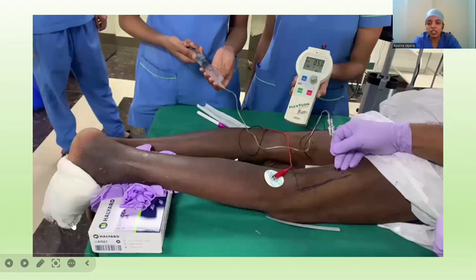Here, as you can see, the patient is positioned in prone position and the landmarks are marked with a pen. So there is the popliteal crease, the tendons of both biceps femoris and semimembranosus, semitendinosus, and the needle insertion point is around 7 to 9 centimeters at the midpoint of that line.